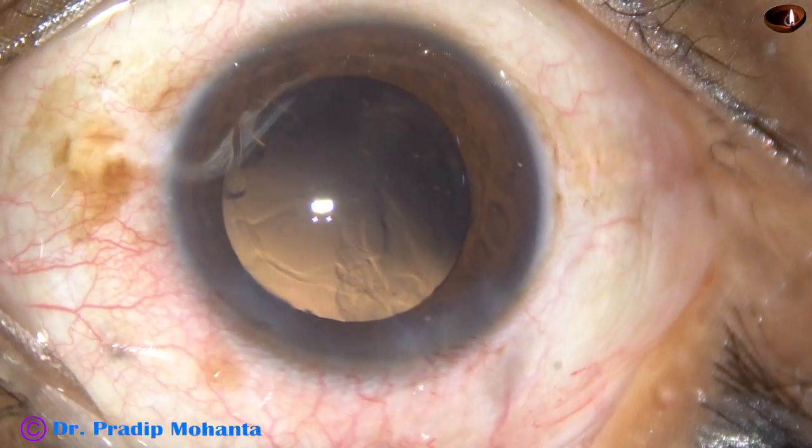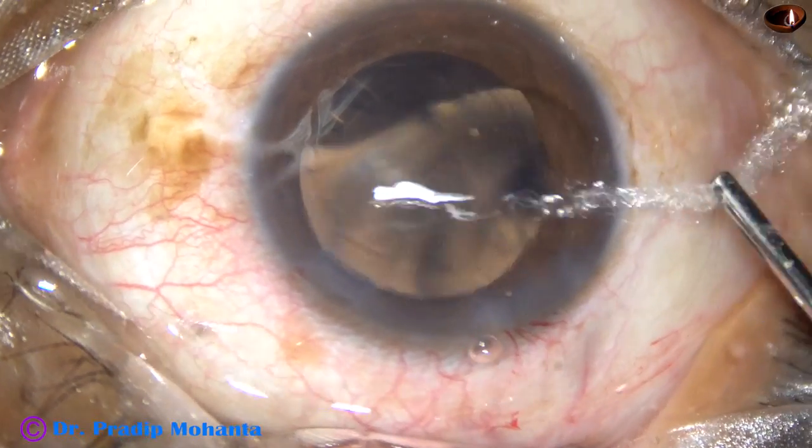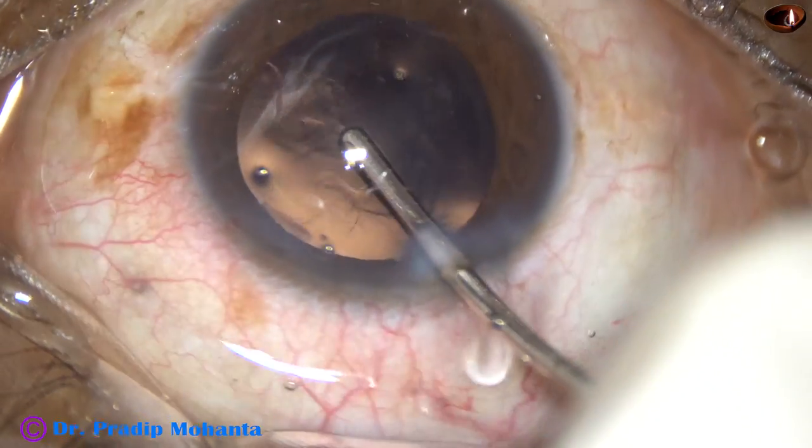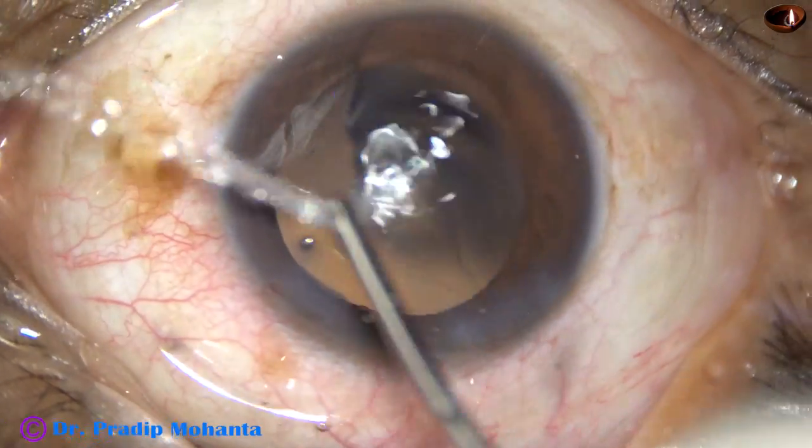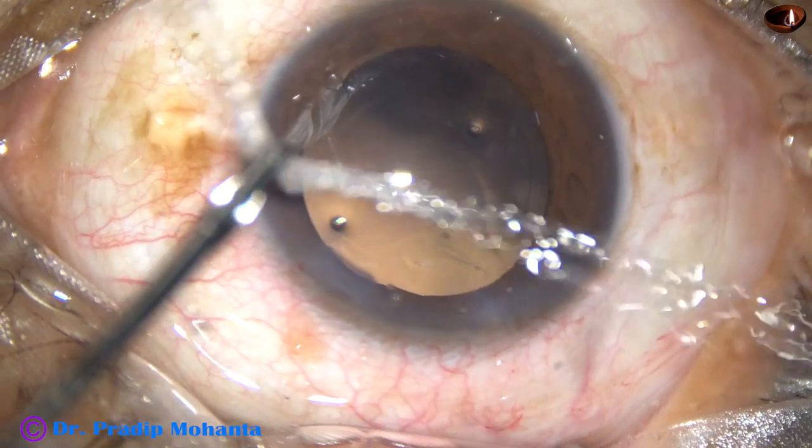The posterior capsule is very clean — no cells in this case. Still, some polishing was done.